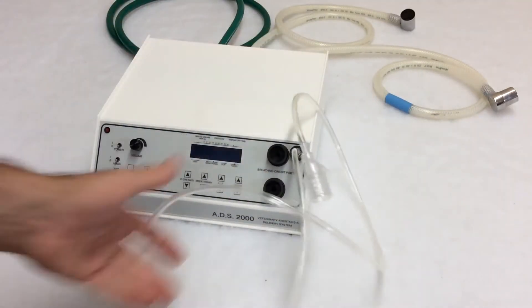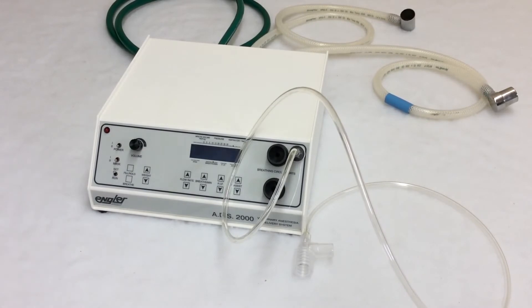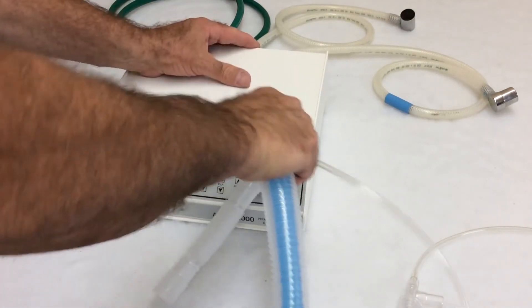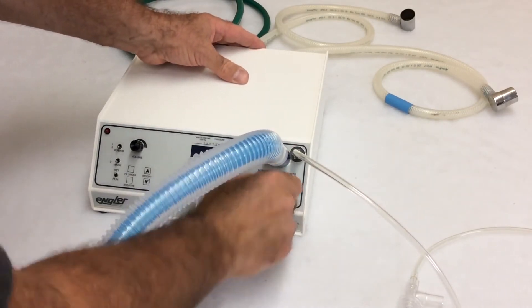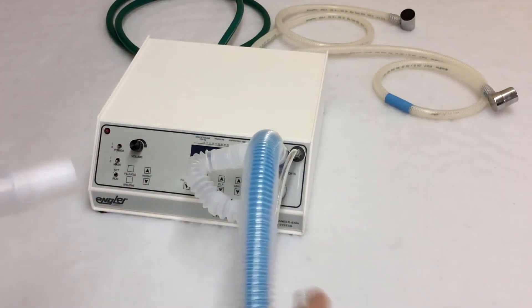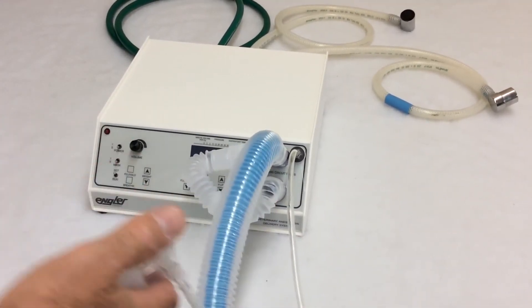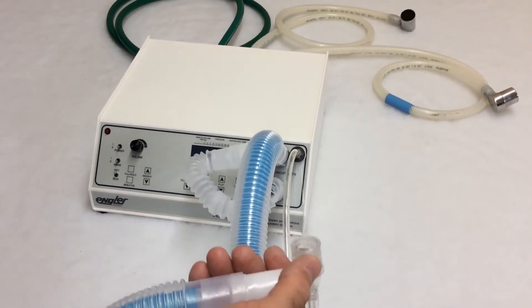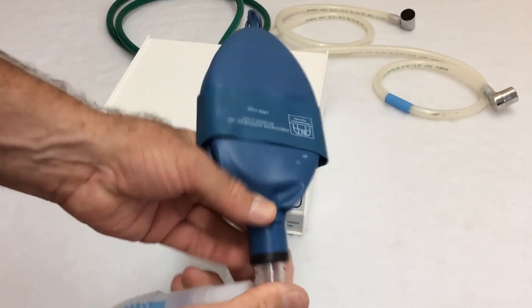Next, we have the breathing circuit — it's a Unilimb Bain circuit. The inspiratory goes on the top, the expiratory goes on the bottom. That connects like this. This would ordinarily connect to your breathing circuit, to your endotracheal tube, but in this particular case we're going to use a test lung just for demonstration purposes.